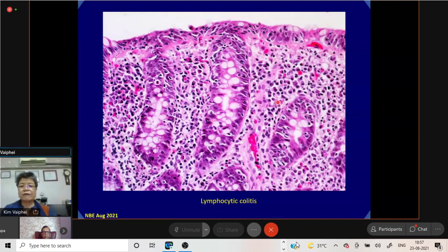And there is increase in inflammatory cells in the lamina propria, including few scattered eosinophils. Maybe there is a little bit of neutrophils also, like cryptitis, but this amount of lymphocytes with a normally aligned crypt, there's just one condition, lymphocytic colitis, nothing else.